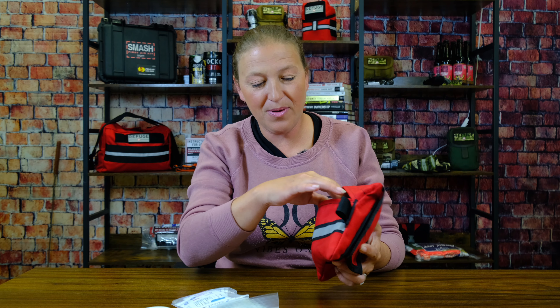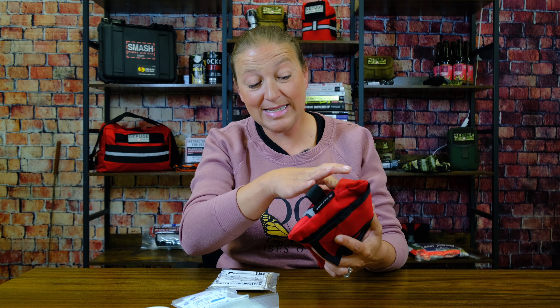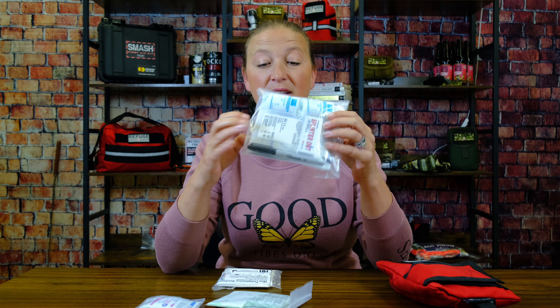Our medical tape. Everything in here is in a nice little easy-to-grab pouch. In our larger pouch, we are going to have our gauze — our 2x2s, 4x4s, rolled gauze — just in case we need a little bit more, if we've got a little bit more major bleeding going on.